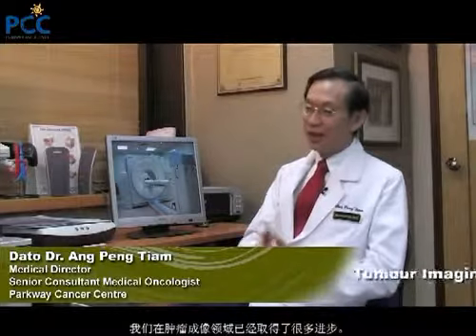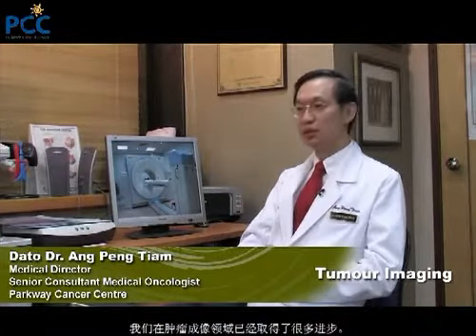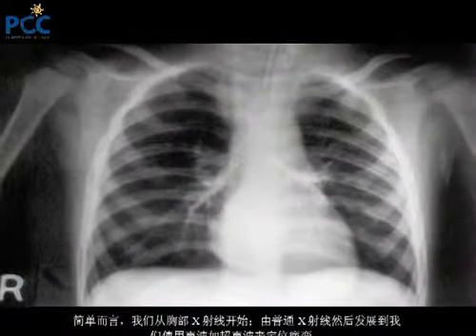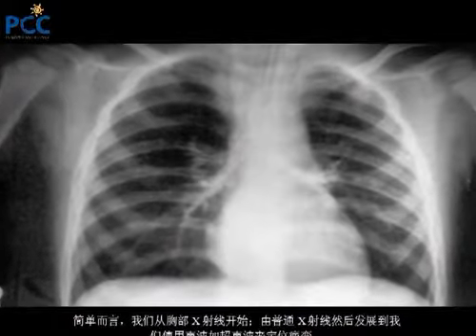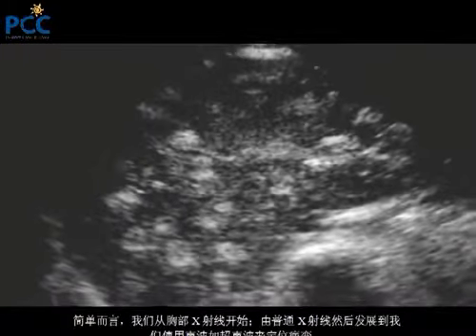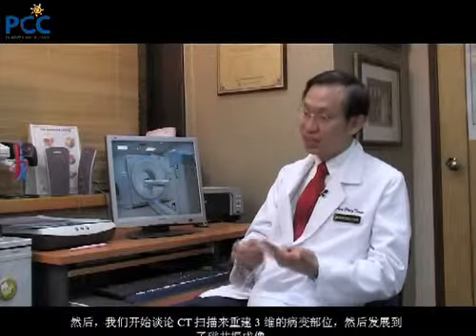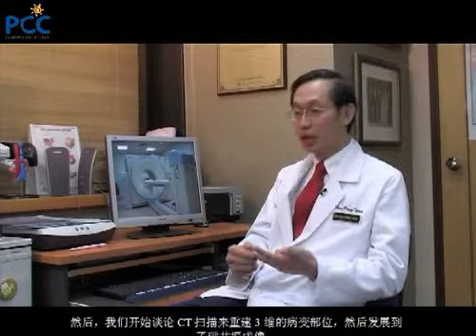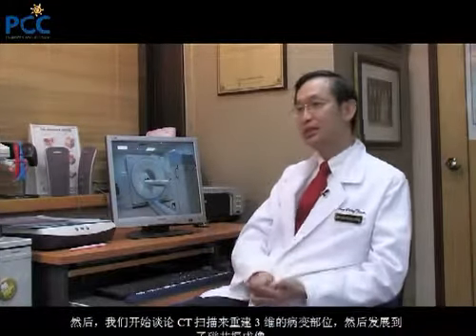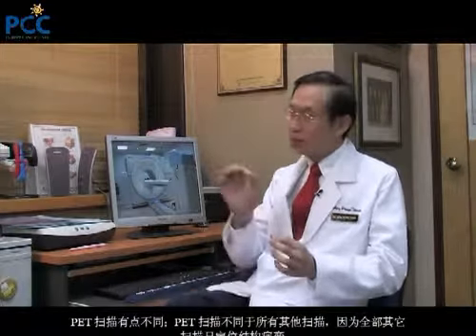There are many advances in the way in which we image tumors. Simply, we start off with things like chest x-ray, plain x-rays. Then later we talk about things like ultrasound, using sound waves to image the abnormality. Then we talk about a CT scan, whereby we can reconstruct, three-dimensionally, what the abnormality is. And then there's an MRI. The PET scan is a little bit different.